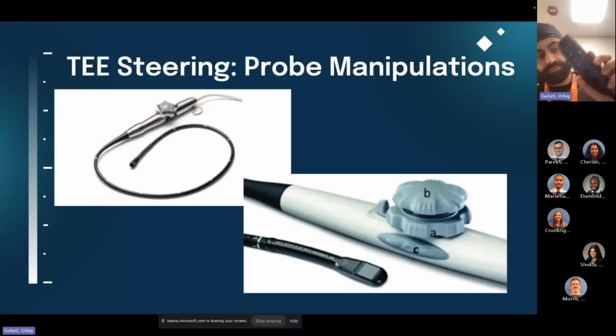So you guys see this? Pretend that here's my knobs, here's the buttons, that C button, and I hold the probe down like this. And then this way I can maneuver the buttons like this, and then I can take the two knobs and control like this. And primarily, once again, you're just doing A and B. So if I turn A this way towards those buttons, as in, sorry, clockwise, then it'll go anteroflex. If I go counterclockwise, it'll go retroflex.